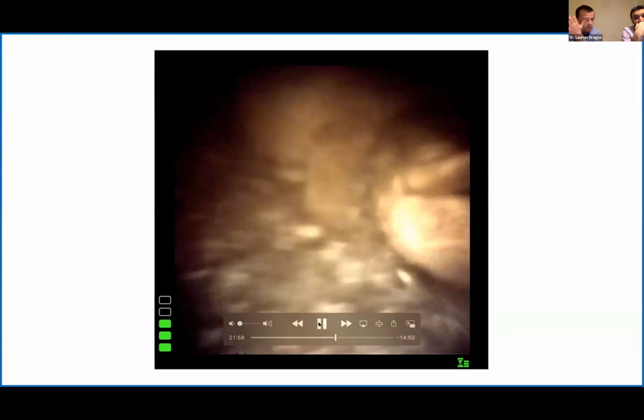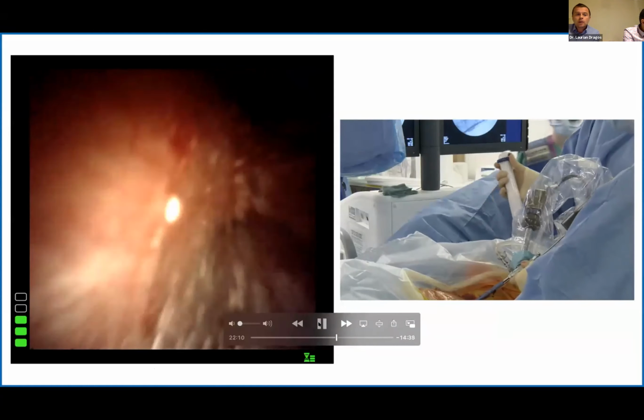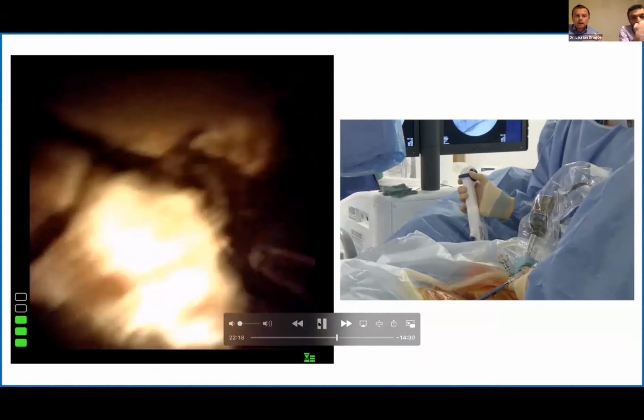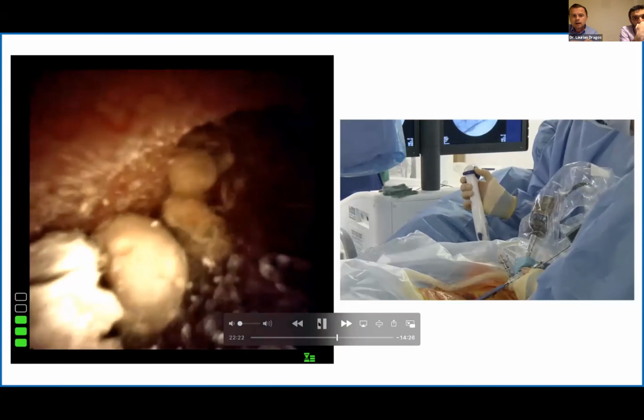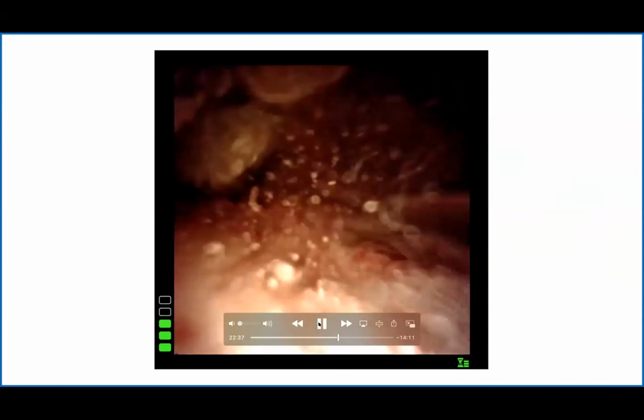Just a couple more questions that have come through. Will Finch has asked, what size laser fiber are you using, and what's the maximum power that you can get with this fiber and this machine? It was a 200 microns, and again, honestly, I didn't try this. I was just using what I needed at that point. I do not know what the limits are with this laser, this machine and this fiber combination. As we all know, more or less all machines have limits with different fiber sizes. So, Will, I'm sorry, I can't answer. Well, Uli may be able to tell us, or somebody technical from EMS may be able to help.